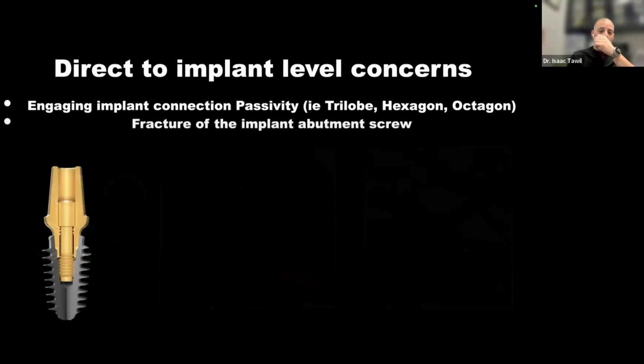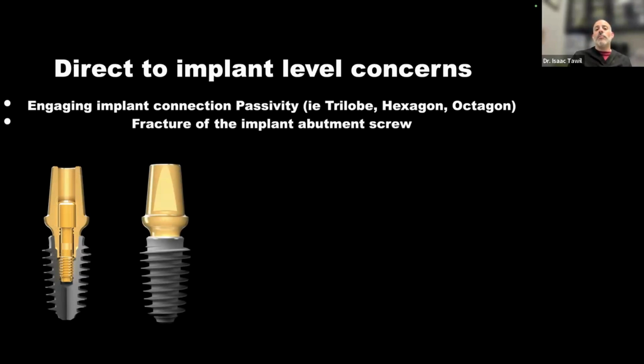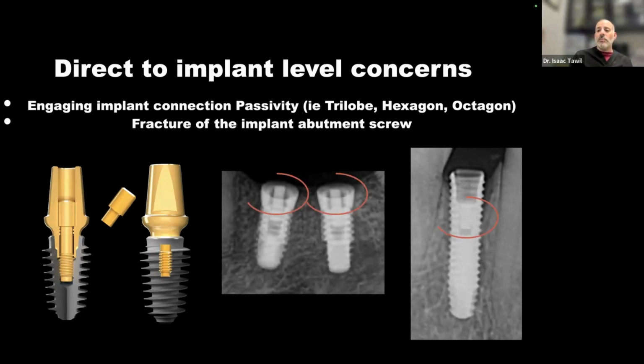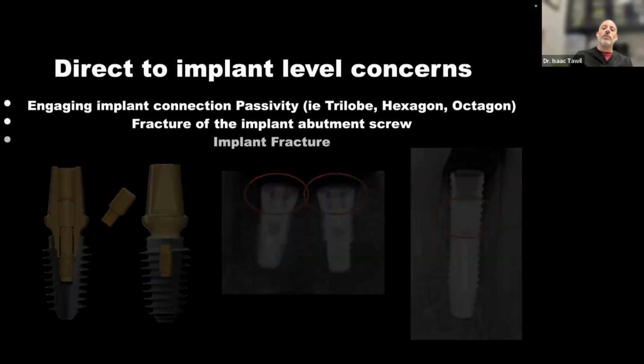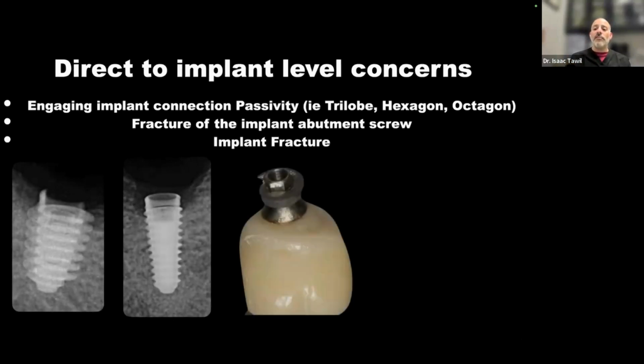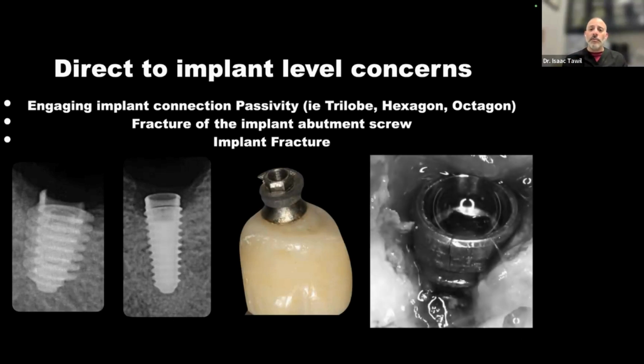The other problem that really becomes an issue to me, and one of my biggest fears, is that when we have an implant and we're going direct to the fixture, we can break the screw. And if we break the screw inside the implant, sometimes it's like this, where we can see it in the middle, we can get them out. Other times it's so deep that we cannot get them out. And now what do we do in those cases? So I'm not a big fan of that. I'm also not a fan of going direct to the fixture because I'm putting extra stress on the fixture itself, and that could lead to the implant fracturing. And these are game over situations.